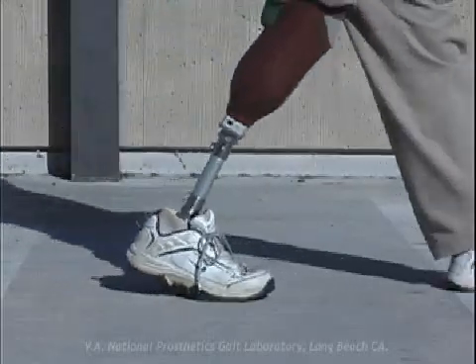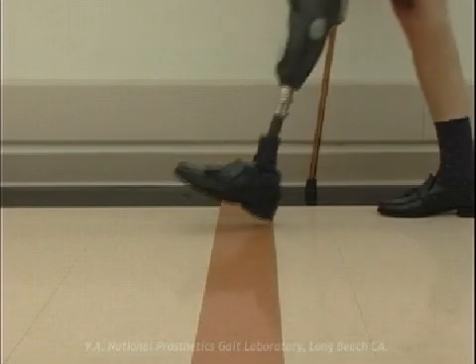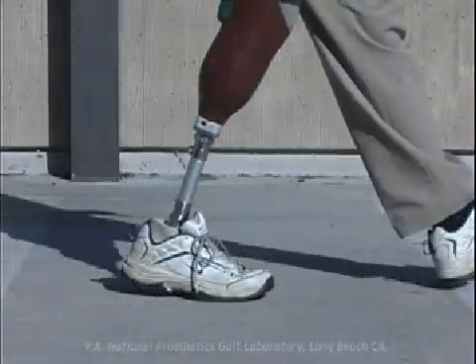Heel cushion compression delays the rate of initial tibial advancement, resulting in reduced knee flexion during the weight acceptance period. Excessive heel compression can be addressed by stiffening the heel cushion.